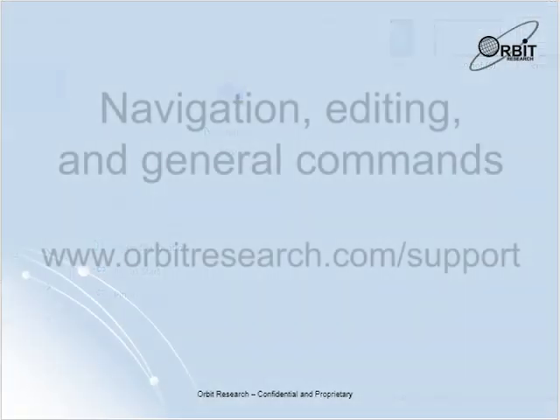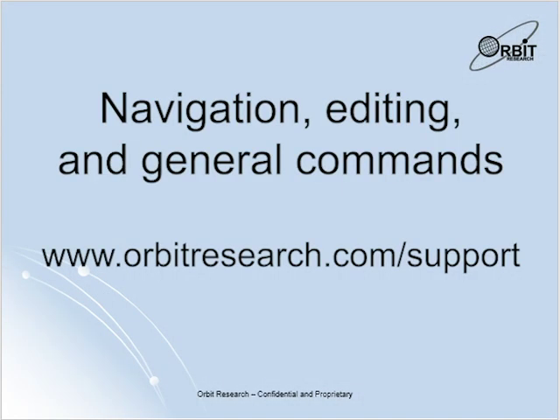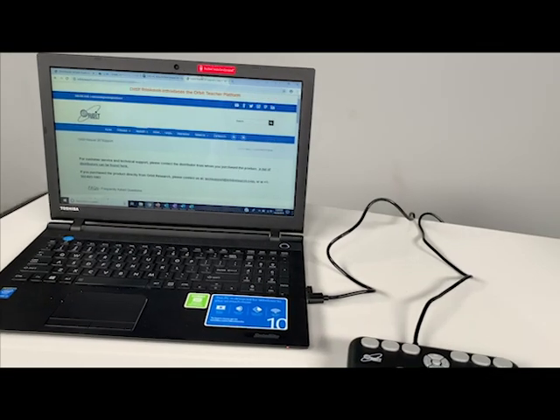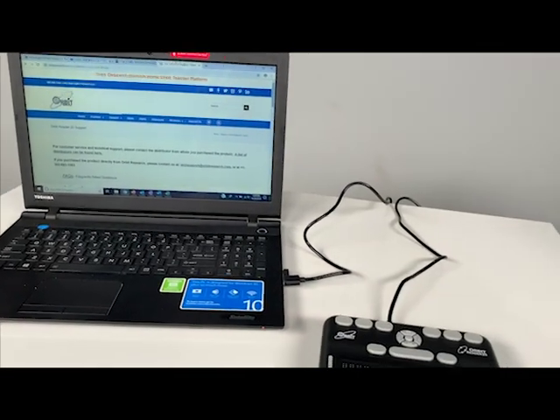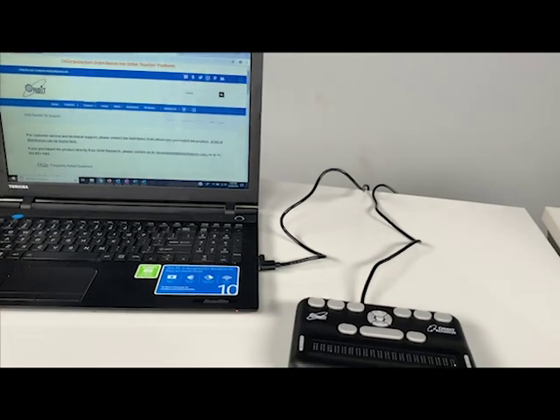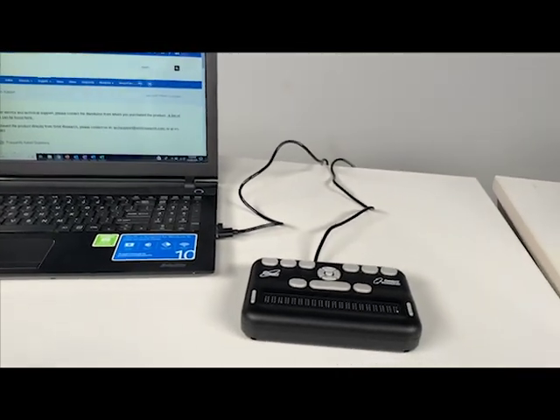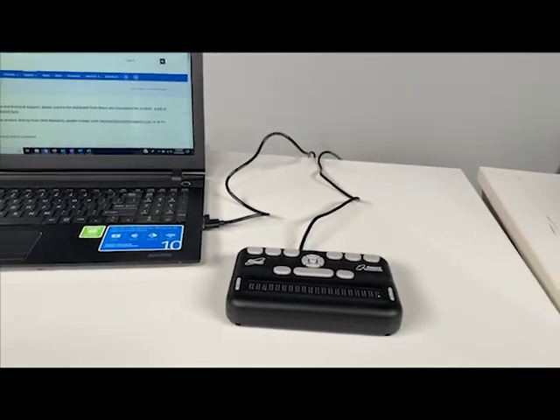For a full list of all navigation, editing, and general commands with Narrator, please check out our Orbit Reader 20 user guide on our support webpage. Your Orbit Reader 20 is now connected to your PC. Continue using both the device and Narrator to navigate around your PC.